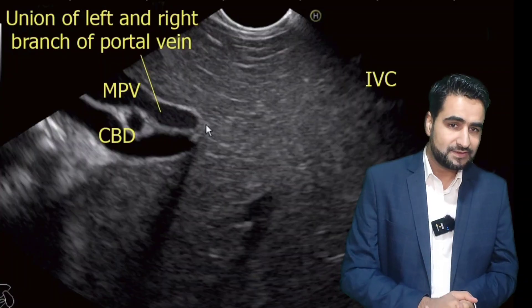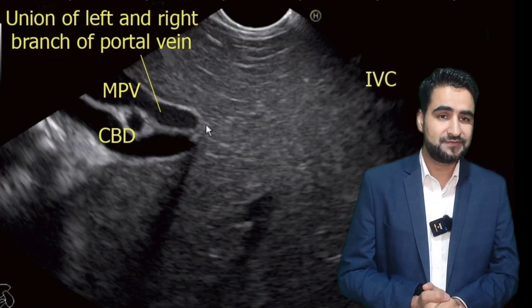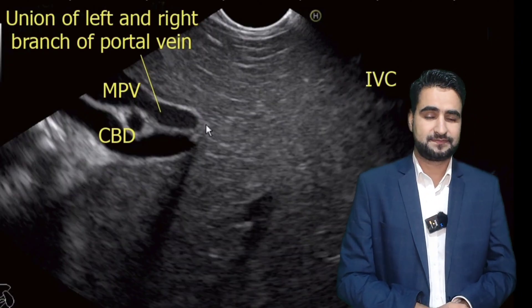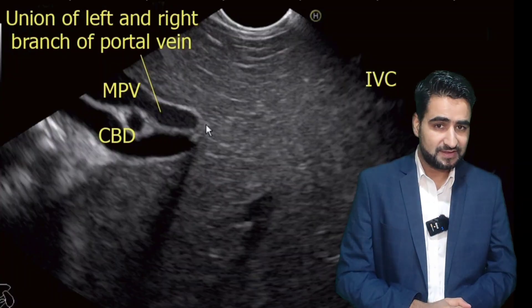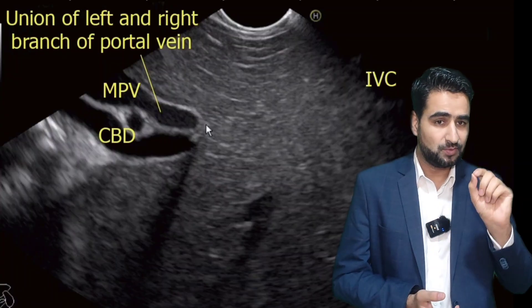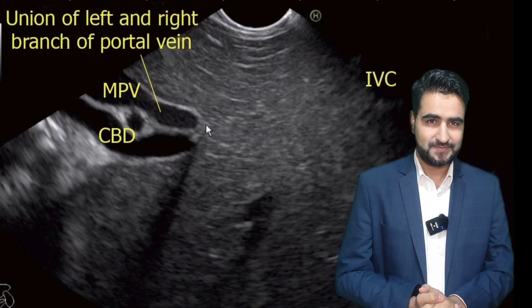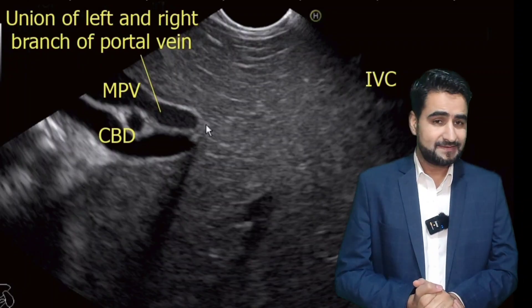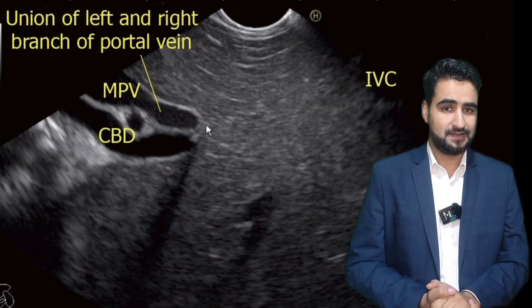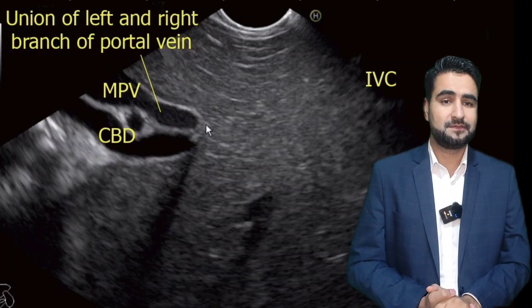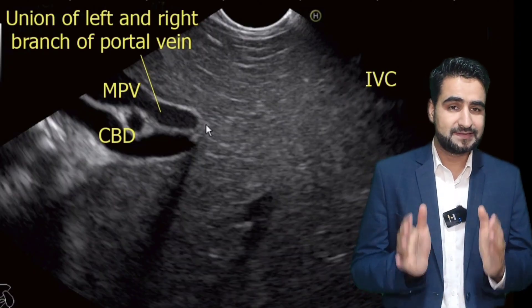With further clockwise rotation, we now reach a critical junction: the confluence of the left and right portal vein branches. Here, you can identify the main portal vein before its bifurcation, with the inferior vena cava appearing posteriorly as a large anechoic structure. The common bile duct sits adjacent to the portal vein. This union point is a key anatomical landmark because it represents the portal bifurcation — a crucial area in both diagnostic imaging and surgical planning.